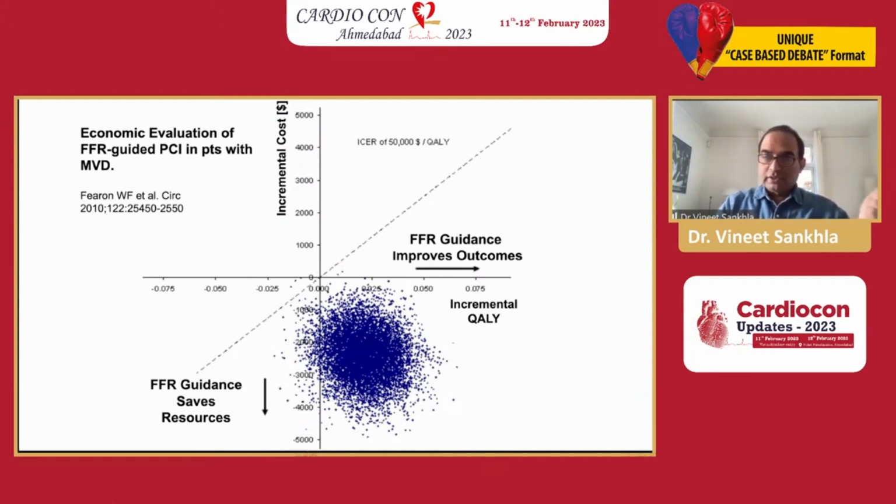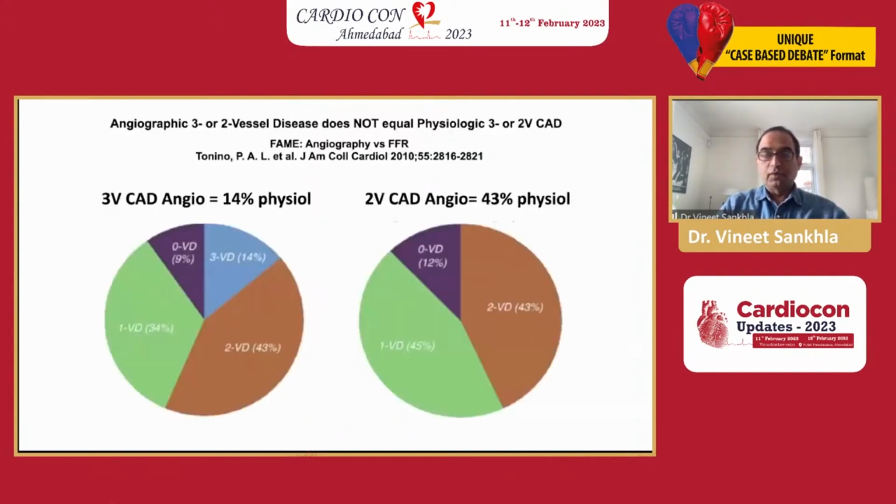So it saves resources, it increases quality of life, it improves outcomes. All the trials have proven outcomes with FFR, and of course, it is very cost effective, and it reduces the cost.